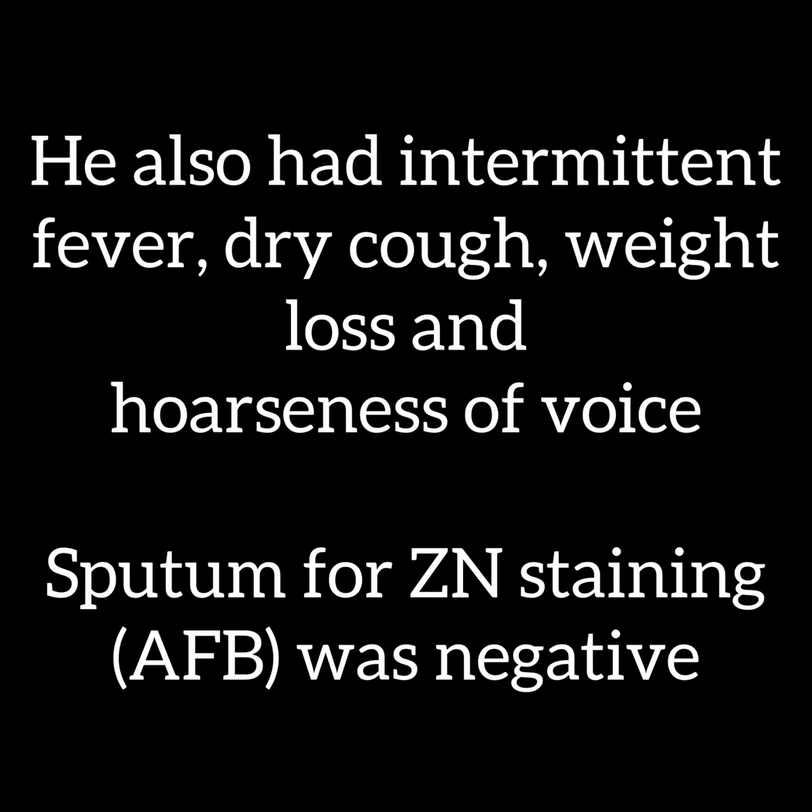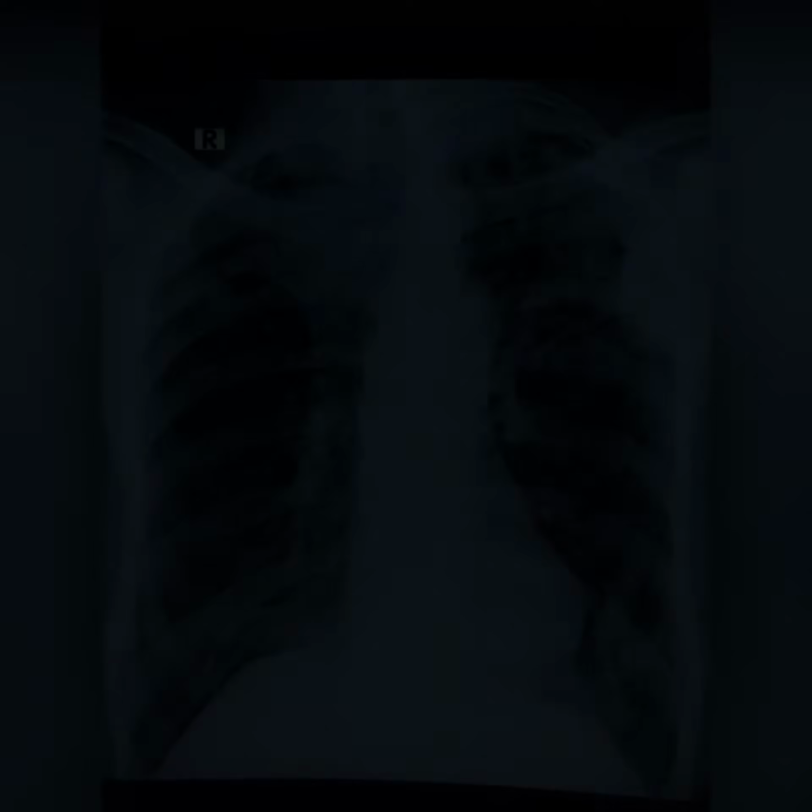I would like to present a 72-year-old male cigarette smoker who was admitted to our unit with pain in the left upper part of the chest for the last 3 months. The patient also complained of intermittent pyrexia, dry cough, weight loss, and hoarseness of voice. Initial sputum examination was negative.